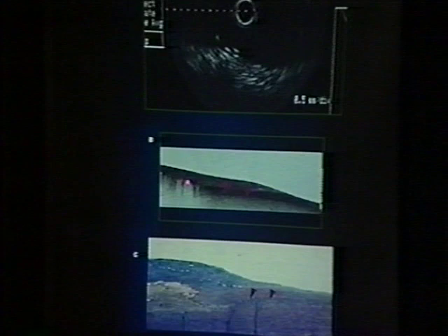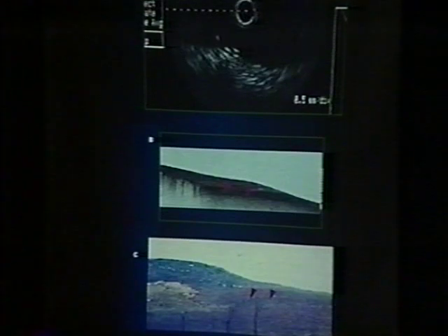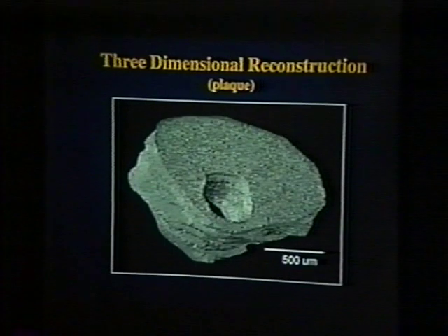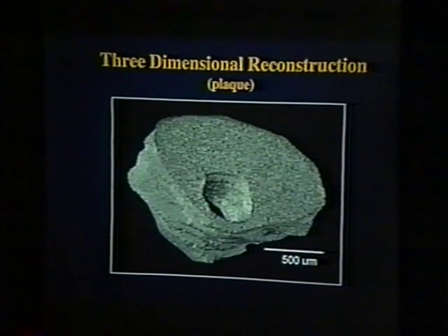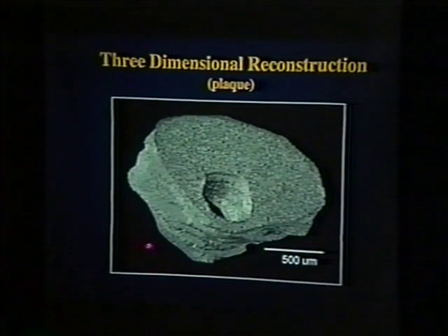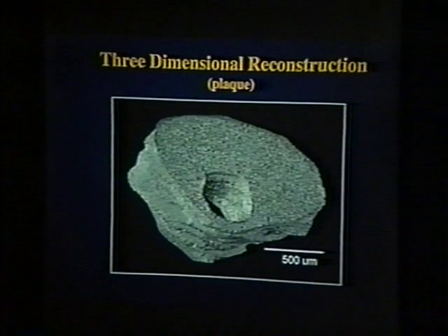Now, we've compared pretty extensively OCT with IVUS. This is a slightly older image, and I'll show you new ones in a second. The right is a 30 megahertz IVUS transducer of a coronary artery. The left is done with a first generation OCT imaging catheter. There's intimal hyperplasia, or thickening of the intima, which is clearly identified with OCT but is not seen in the IVUS image.